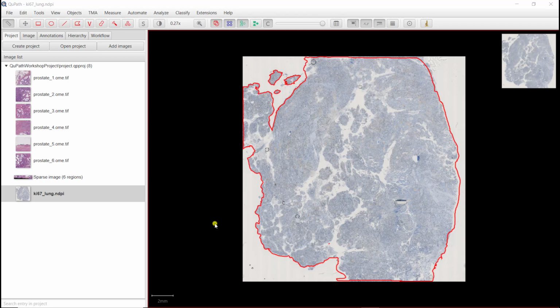In this video, I'm going to show you how you can use QuPath to do a nuclei segmentation with Stardist. Stardist is a deep learning approach to instance segmentation, which is individual identification of objects, even for complex objects. It's mainly used for nuclei segmentation, and it's probably the most used deep learning approach to segment nuclei in microscopic images. To do so, you need to first install the Stardist extension for QuPath.